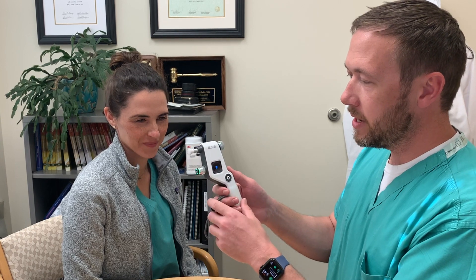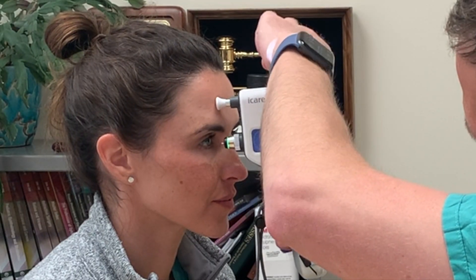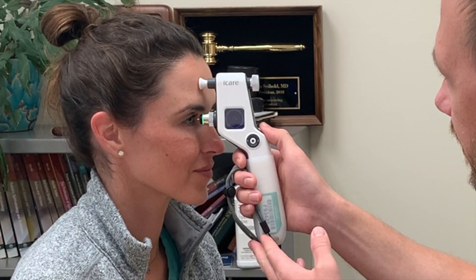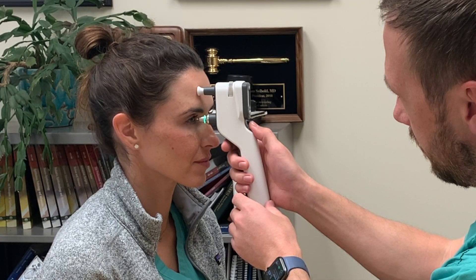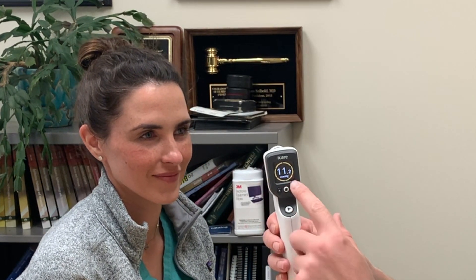Now we're ready to take our reading. This is our volunteer, Dr. Ertel. You can see a flashing play button indicating that we're ready to take a reading. First, we'll adjust the forehead rest until we're approximately four to eight millimeters away from the eye. Once it takes six readings, you'll hear a long single beep and it'll give you the average reading on the screen, which you can record. Now with the IC200, much in the same way — you want to see the flashing play sign, adjust the forehead in a similar fashion, and you'll get a long beep and a pressure reading.